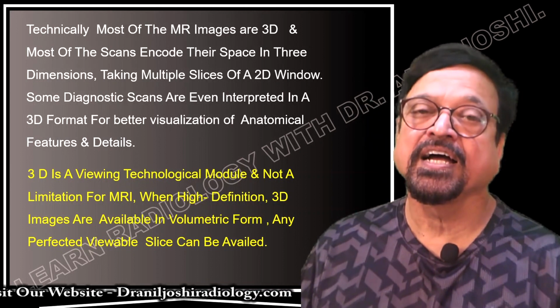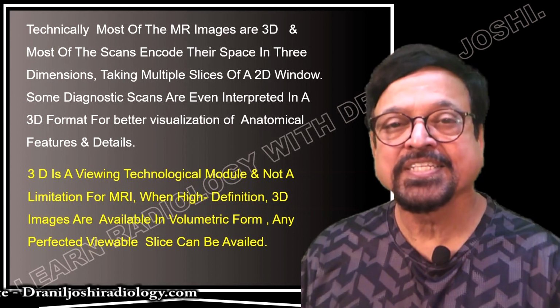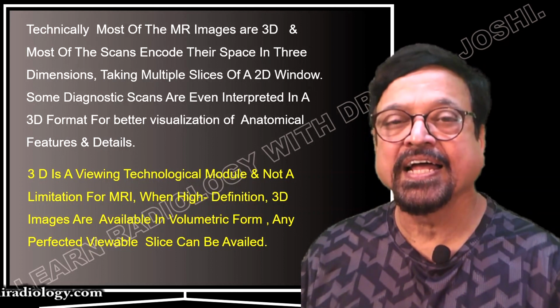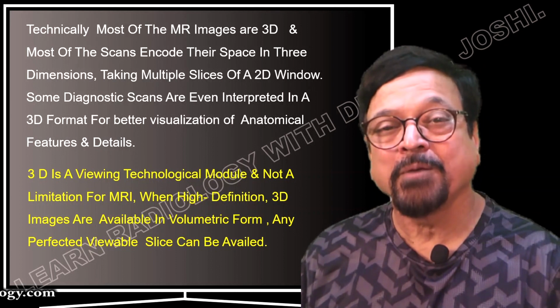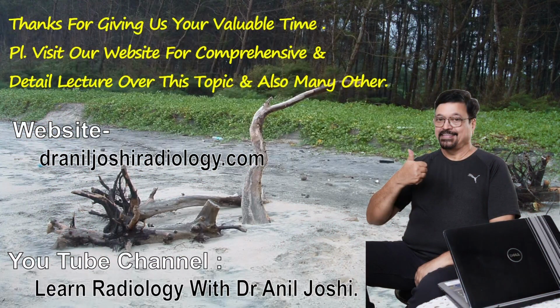So you have got a 3D data volume. You want to extract axial, you want to extract coronal, or you want to make two oblique sections at the same time. Everything will be possible since you have got volume data.